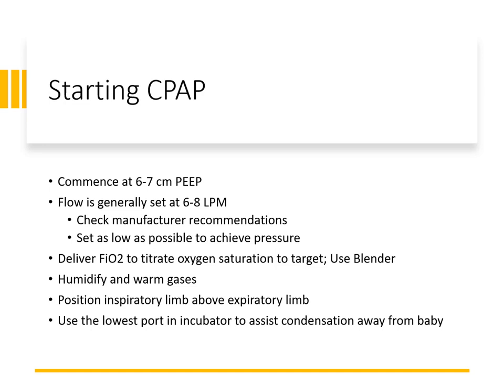The gases have to be humidified and warmed. And the other important thing is we have to position the inspiratory limb above the expiratory limb, and we should use the lowest port in the incubator so that if there's any condensation happening, it will drain away from the baby.